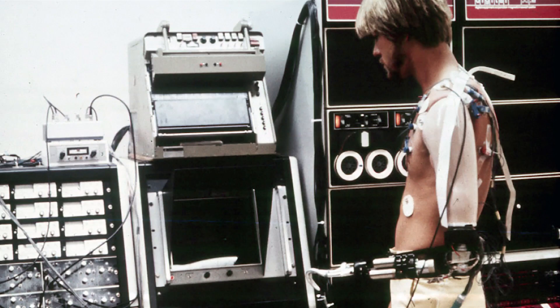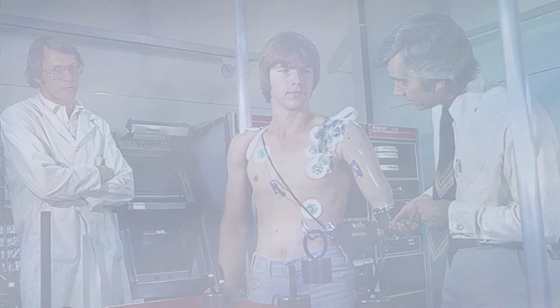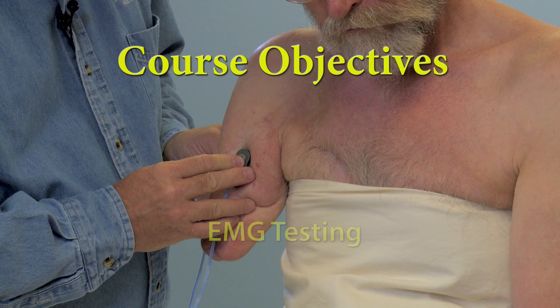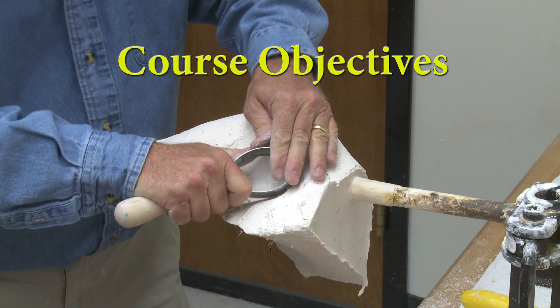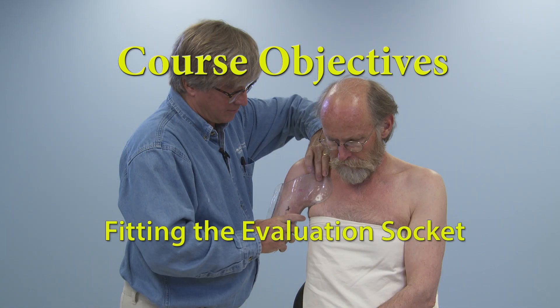With the development of the Utah arm, new molding and fitting techniques were developed to provide consistency in electrode contact and translation of body motion to control the prosthesis. These techniques are shown in this presentation. You'll learn EMG testing for optimal electrode site selection, the molding technique for a transhumeral amputee, positive mold modification, and fitting the evaluation socket, resulting in a well-fitting dynamic prosthesis.